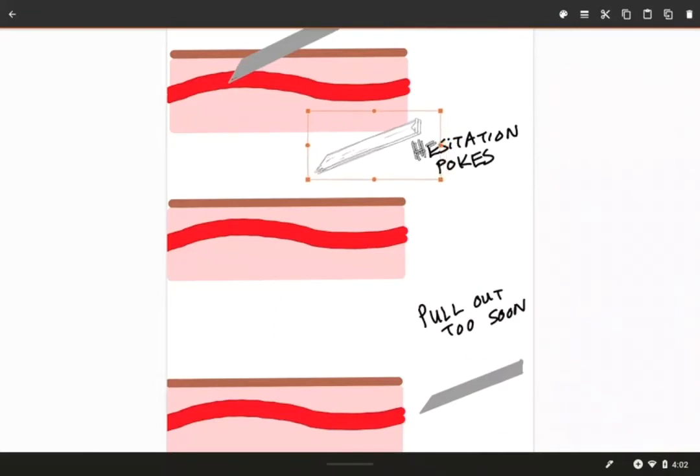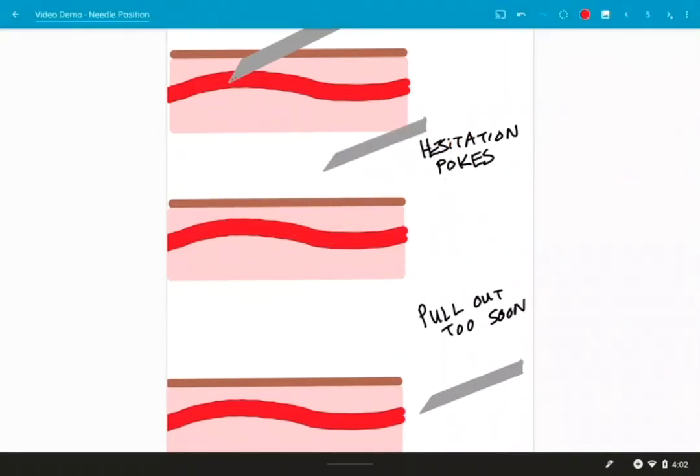So you want to start at about here, and if you go here and you're like, oh, wait, I changed my mind. I'm going to come out. Same problem as before. If you go partially into the vein like that and then come out again, you've created a wound where that needle had been. And that gives an opening for the blood to get into the tissues here. And it also gives a path to bleed onto the arm.